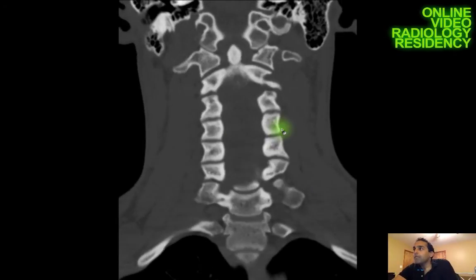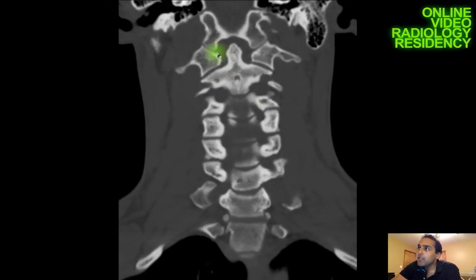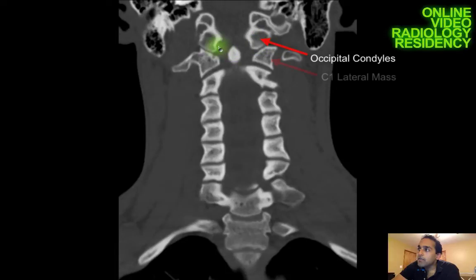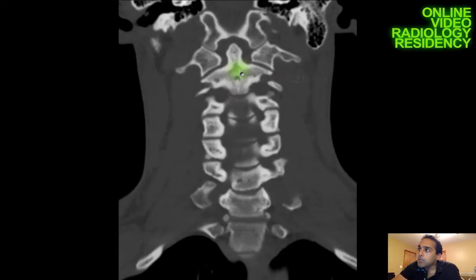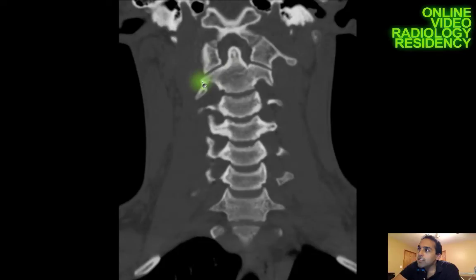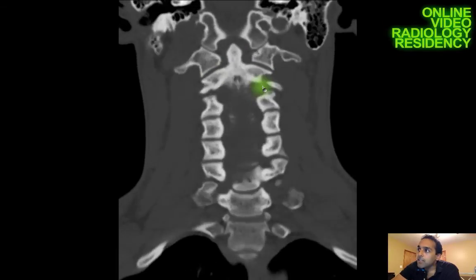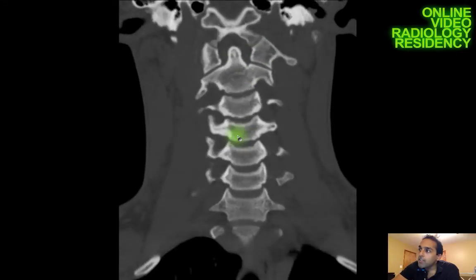Once I've gotten the most information from the sagittal plane, I switch to the coronal plane. Here you can see the occipital condyle anatomy and its relationship to the C1 lateral masses. I can see the dens poking up through the middle and the entire C2 vertebral body — C2 is the most commonly fractured vertebral body, so I give it a good look in multiple planes. About half of cervical fractures occur at this craniocervical level.